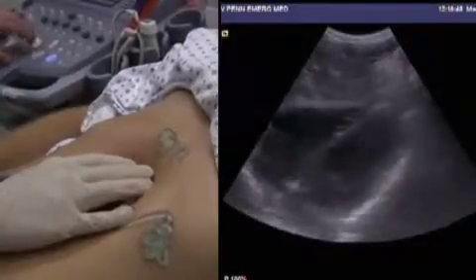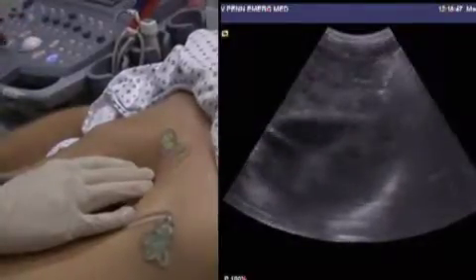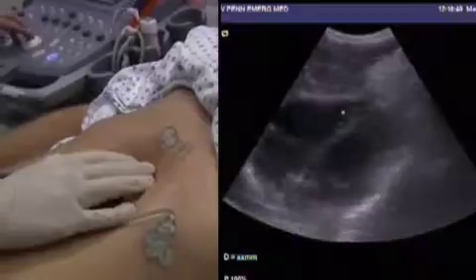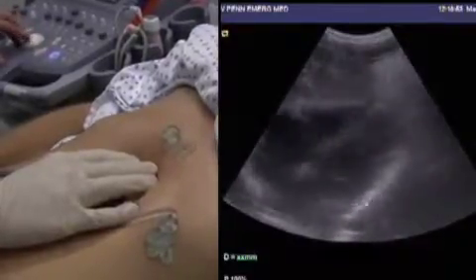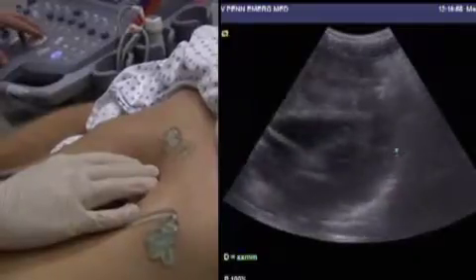Oftentimes we have to increase the gain a little bit. The anterior pericardium is right here under the marker on the screen, and the posterior pericardium back here. There's no free fluid.